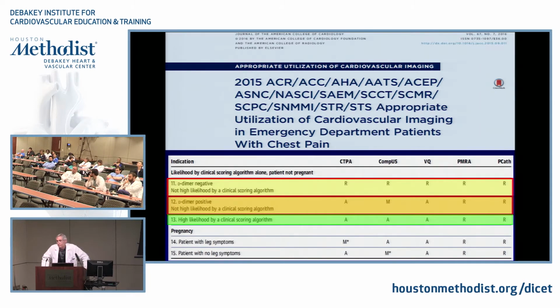So why can't radiology gate? They can. They just don't. Because? You'd have to ask them. I mean, most radiologists don't gate images, even though the literature out there would really say that it's the better way to do it. Most radiology departments don't gate. So they have the technology. It's no big deal for them. Yeah, they can do gating, but they don't do gating. Yeah, and we do gating all the time because it just gives crisper images.